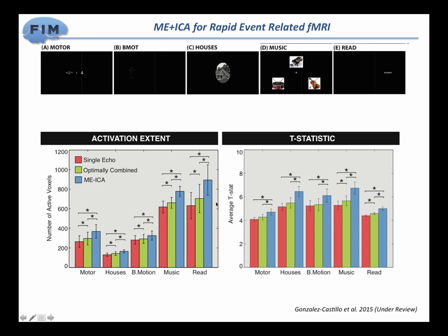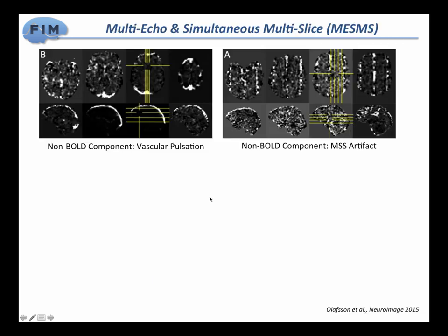I think partly because this was very good data. These are subjects that didn't move that much, so there is less potential room for improvement. So one thing to do is, if we have worse data, maybe potentially pediatric data, where kids tend to move more, maybe we would be able to see a higher increase. But here it's still significant. It's always in the right direction. So if anything, it's just going to help you with your task-based data.